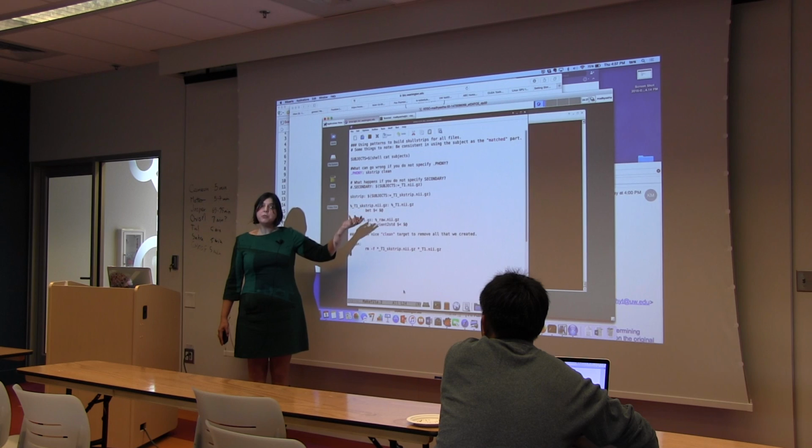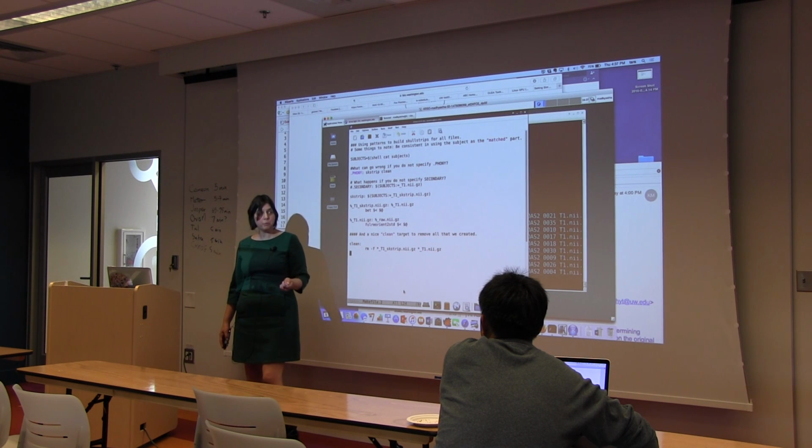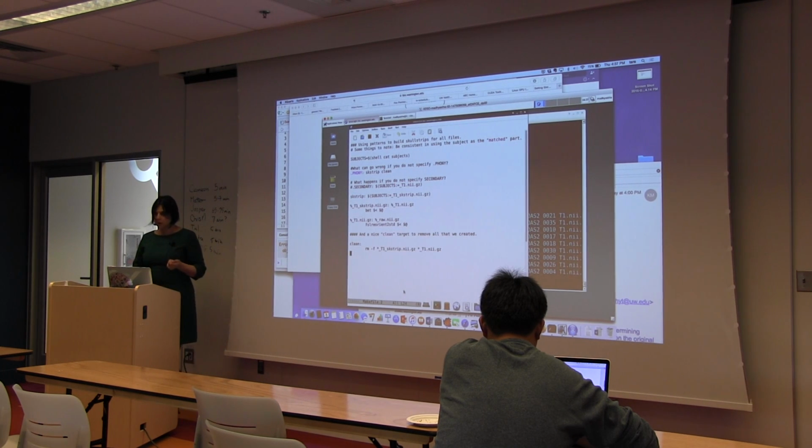These are things that will be produced along the way and I want to see them. So in neuroimaging applications, those kinds of things are things like your 4D resting state scans that are registered to standard space. You probably want to look at them or some image derived from them at some point to make sure that's correct, but you don't want to keep those around, otherwise your disk will become pretty full. I harp on the disk space. It's a big problem for us.